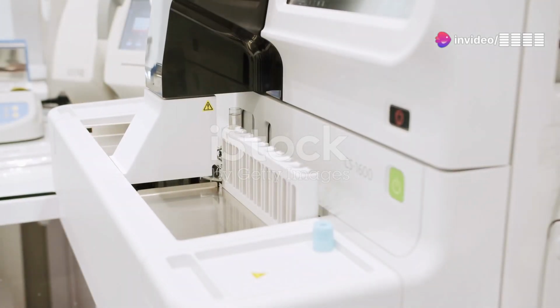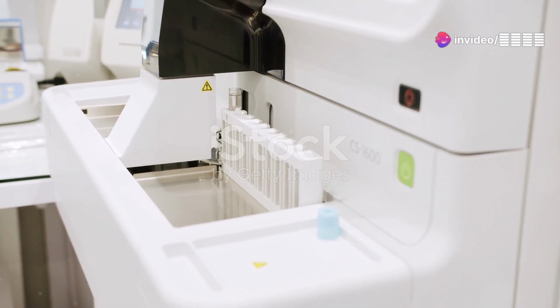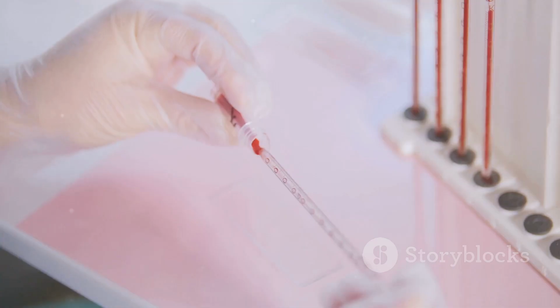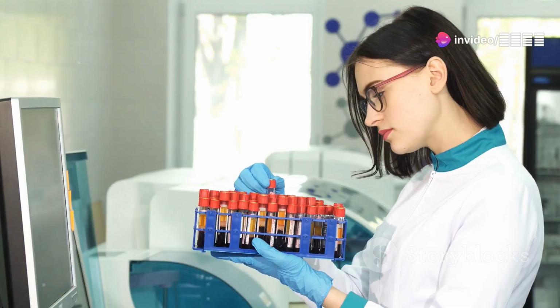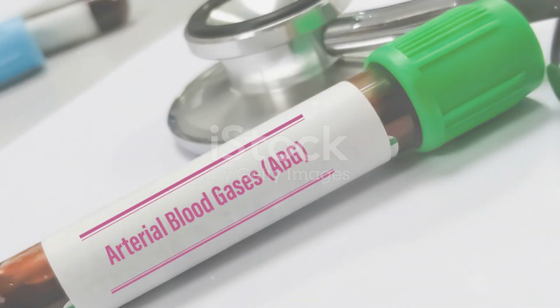An ABG test measures key components, providing critical information about the body's respiratory and metabolic state. These include pH, PCO2, PO2, and HCO3. pH reflects blood acidity or alkalinity. PCO2 measures carbon dioxide pressure. PO2 measures oxygen pressure. HCO3 measures bicarbonate levels.